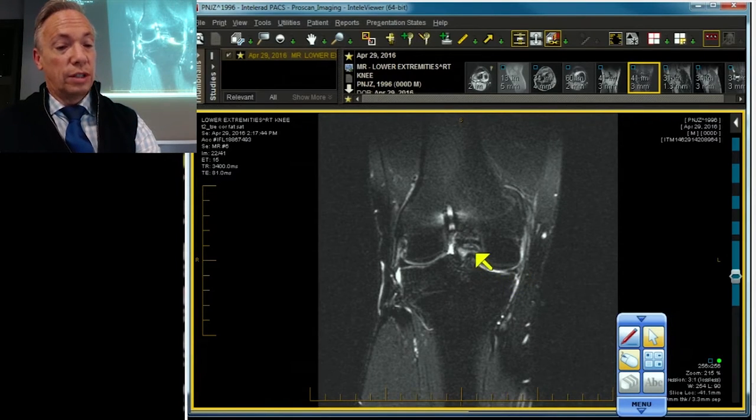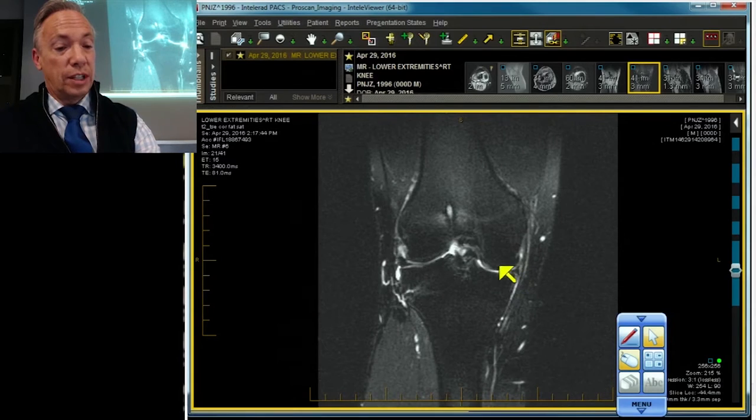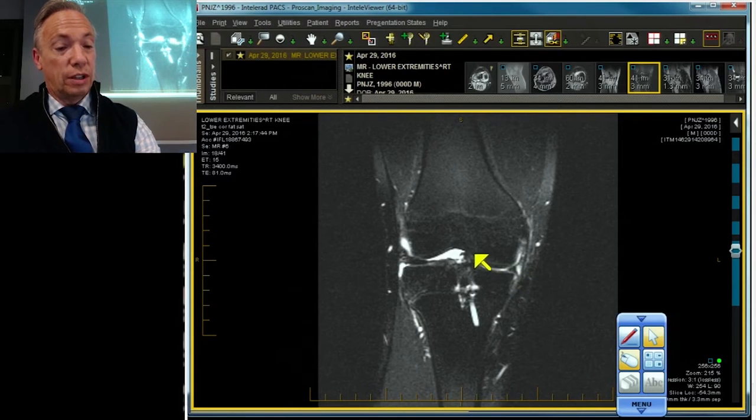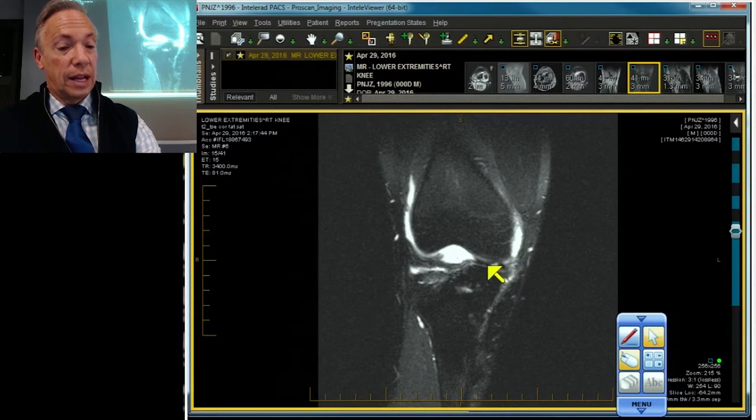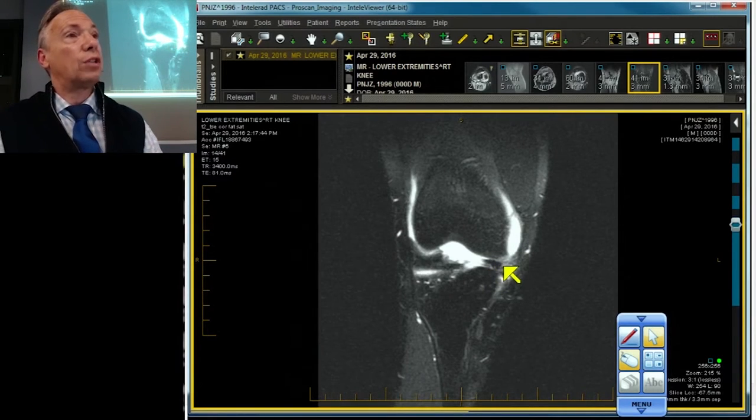Continuing forward: meniscus, fragment; meniscus, fragment; meniscus, fragment. And now they're going to come back together again — there they are, finally coming back together all the way in the front.